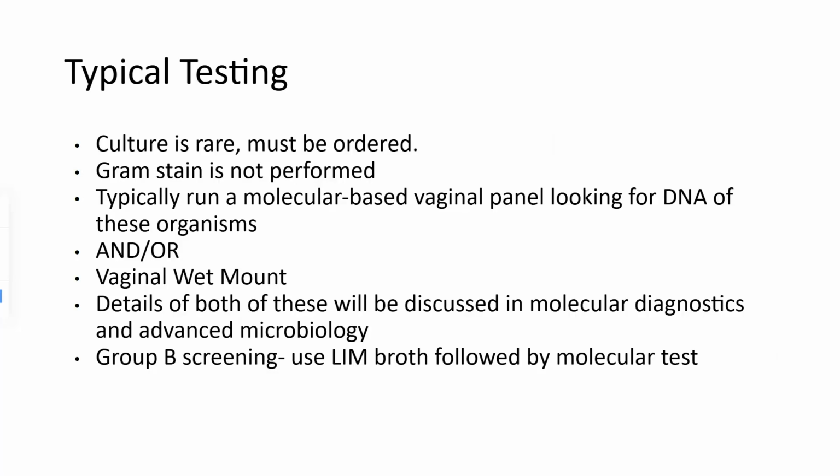Typical testing: culture is rare. It must be ordered. Gram stain is not usually performed. Typically we run a molecular-based vaginal panel looking for the DNA of key organisms that we would find in the specimen, or you could perform a vaginal wet mount. Details of both of those are going to be discussed more in molecular diagnostics and advanced microbiology, but I will go through some basics in this course.